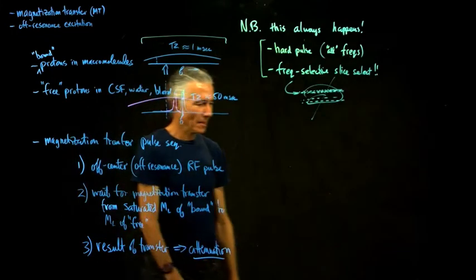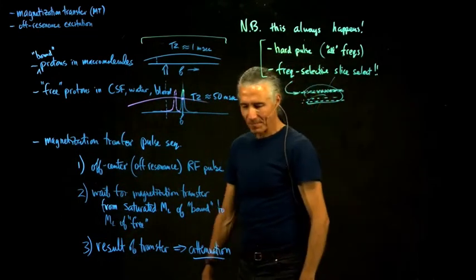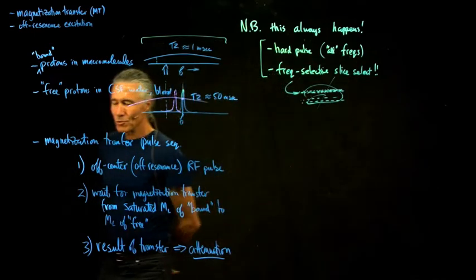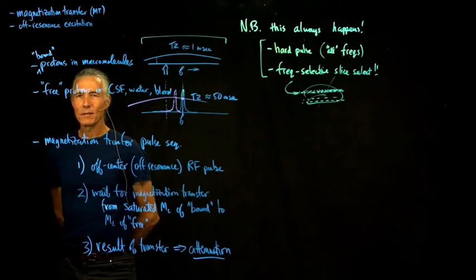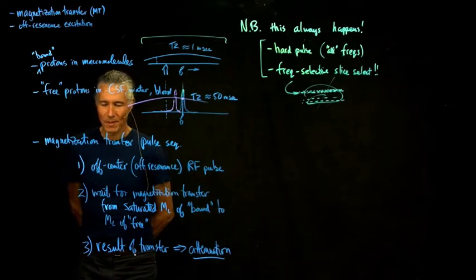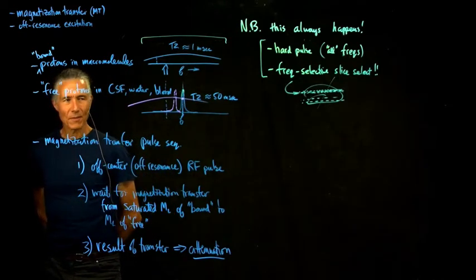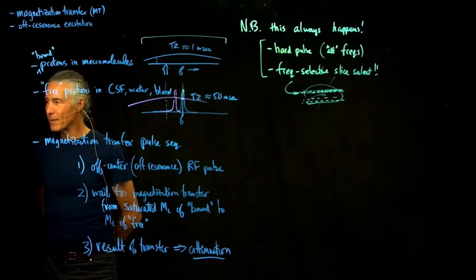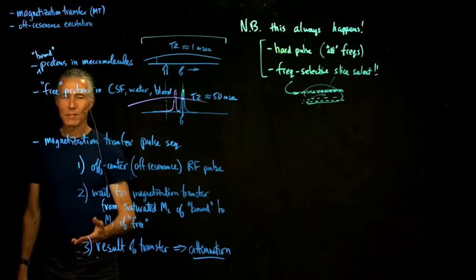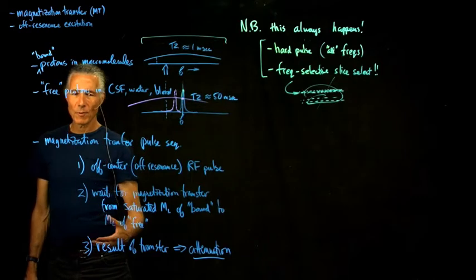So what is this used for? So you can do a magnetization transfer scan. We have the London pulse multi-echo flash sequence that I got from London when I was working there, has the possibility of doing magnetization transfer, and many pulse sequences on the scanner have the ability to do magnetization transfer weighting. It's not very hard.